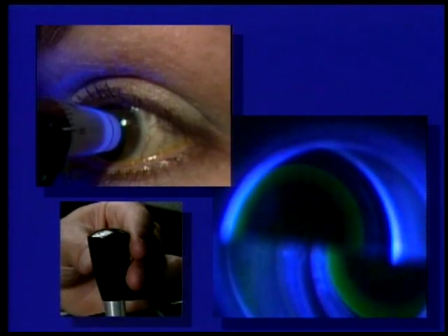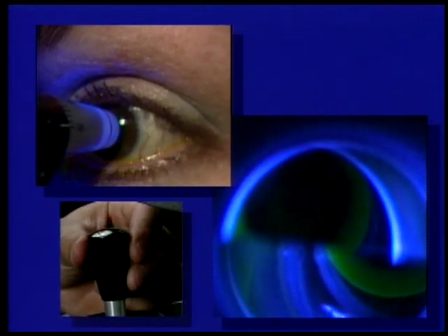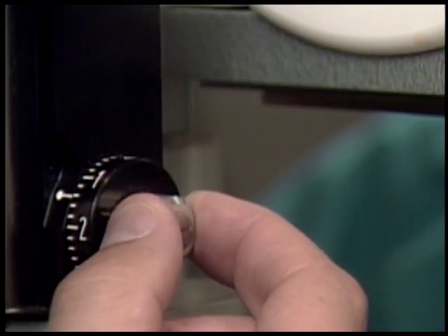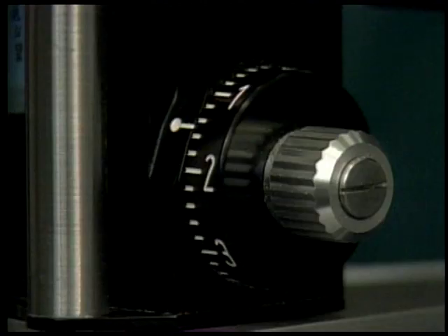The slit lamp should be adjusted up or down to get 2 exact semicircles. Once the tip is properly aligned and positioned, the applanating force on the cornea is varied by turning the dial until the inner borders of the fluorescent mires barely touch. Intraocular pressure is then read from the scale on the tonometer housing.